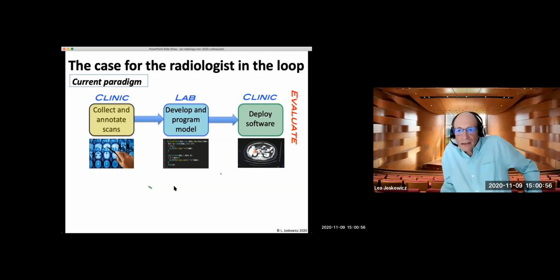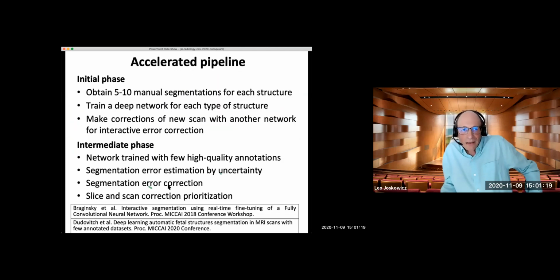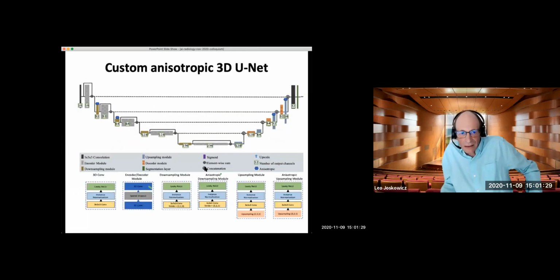Okay, so the answer there is technical. First of all, you have slices. If you have 8 data sets, you have about 800 slices, number one. Number two, you adjust the loss function and the augmentations. You have to work it so that the network, this network I showed, which I didn't go into detail, has a set of parameters that prevents overfitting. Otherwise, you end up exactly like you mentioned. So what you see here is a customized network that prevents this overfitting from happening.